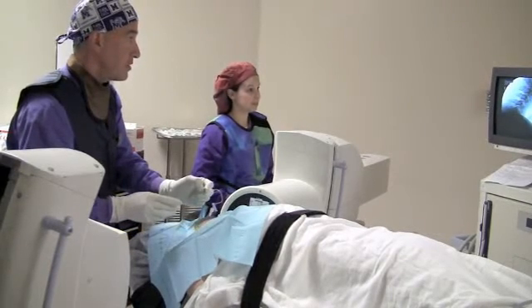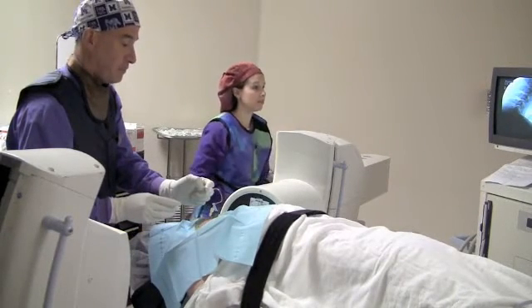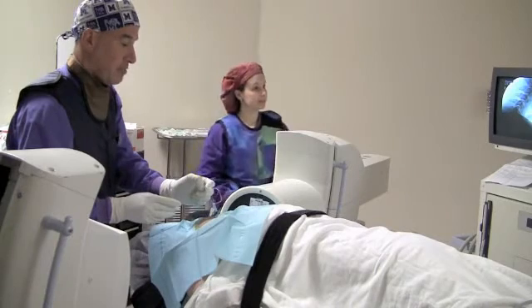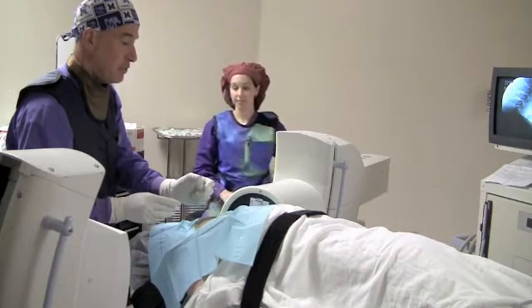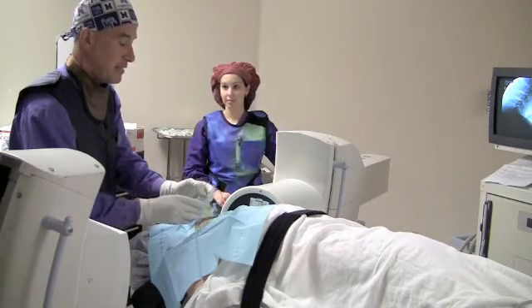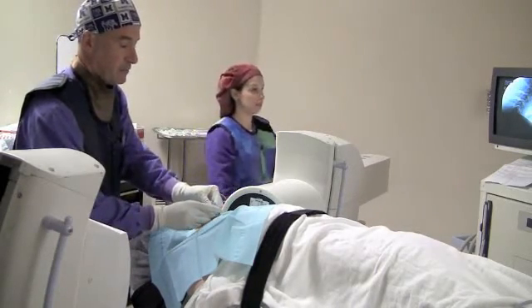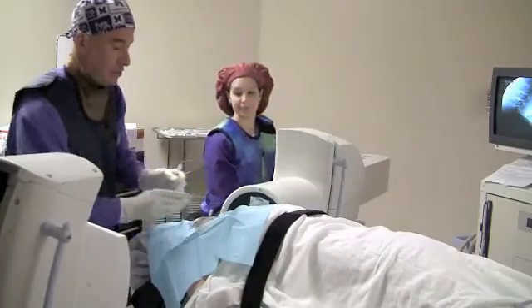All right, we're just injecting there now. You're doing great. You might feel a little something down in there, but we're right at C6 right there. You're doing good. Two more.